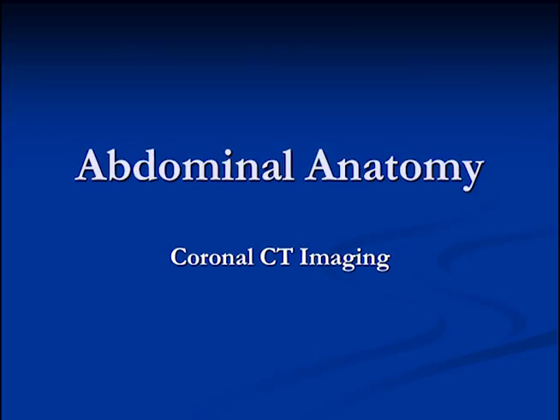If we turn the study around and do what we call coronal imaging, it gets a little easier to see what we want. Most of our CT scans nowadays are 16 or 64 slice and can easily recreate all of the images in coronal or sagittal format. We're going to have a look at the coronal imaging now and look at some of the structures we can see.